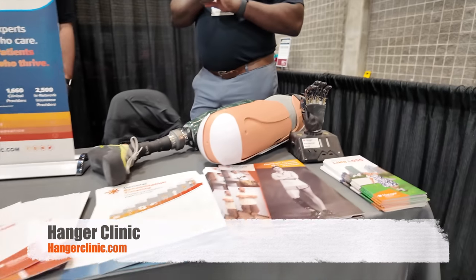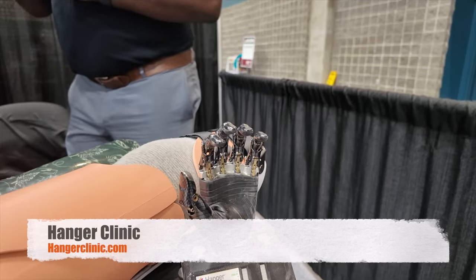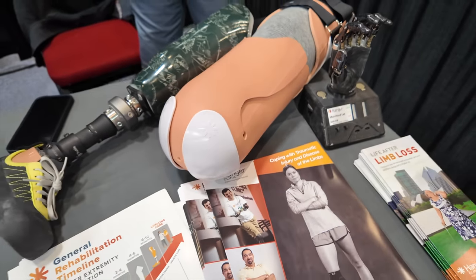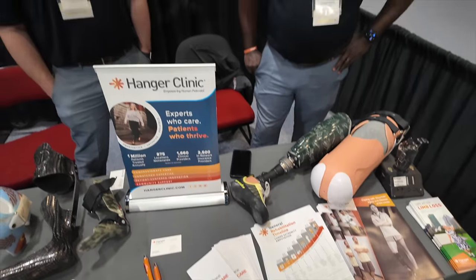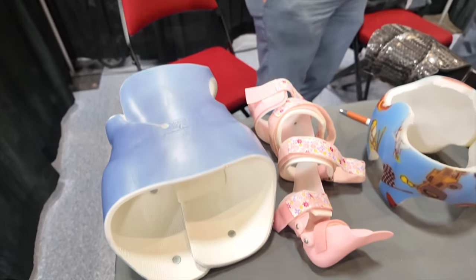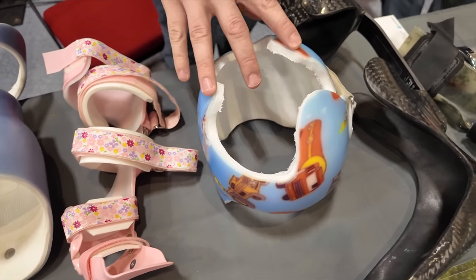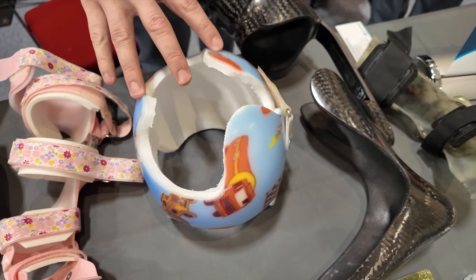All right, so we are here with the Hanger Clinic. Fellas, what am I looking at? So we do orthotics and prosthetics. Any bracing, going from custom foot orthotics all the way up to the hip as well. Braces for foot drop. This is for scoliosis. Little babies with maybe some flattening of the head called plagiocephaly.